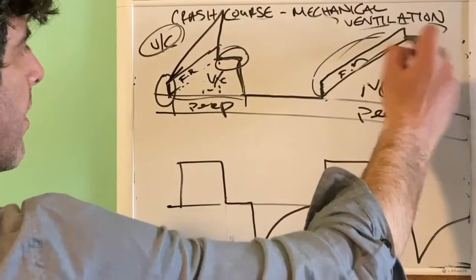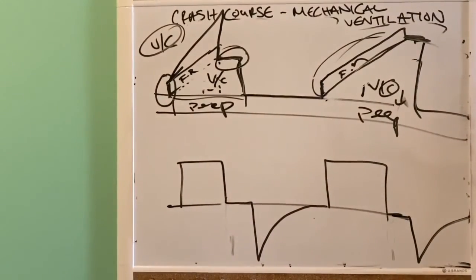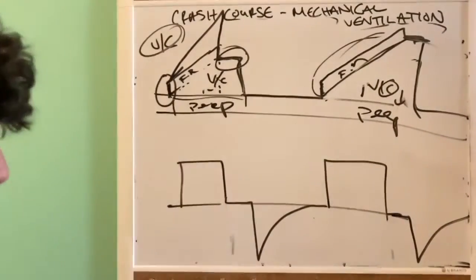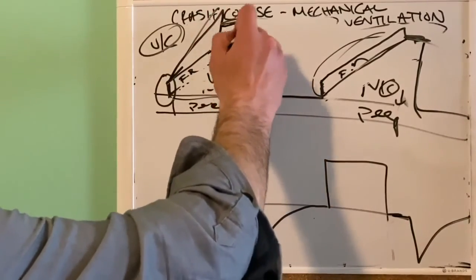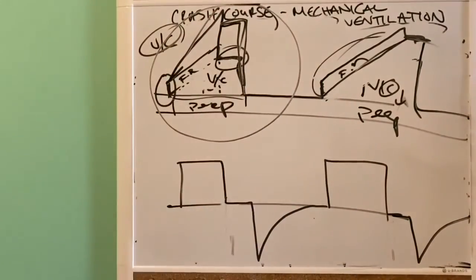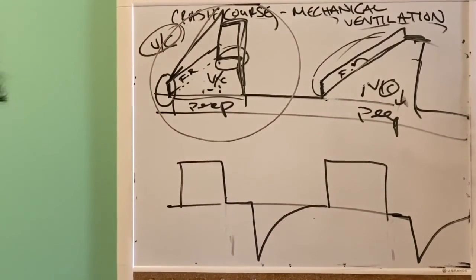All right. Let's say you get a pneumothorax and at the same time you get a bunch of gunk in your tubing. Well, this will go up, and this will change too. All right. So you can actually also look at your waveform, especially on volume control, to try to determine some of the pulmonary mechanics.